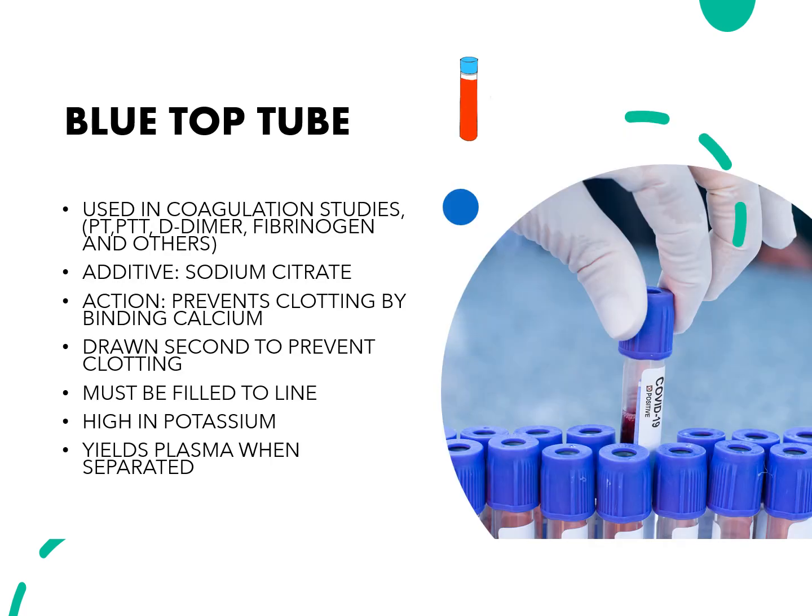The blue top tube should be immediately after the blood cultures or first if you're not doing blood cultures. The reason being, there's a few reasons. They're used in coag studies, so you want to get the blood before it clots. Also, the additive in the blue top tubes, the sodium citrate, binds to calcium.